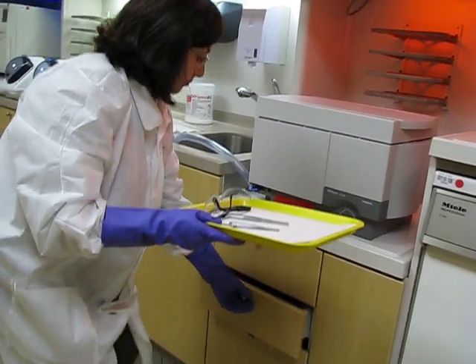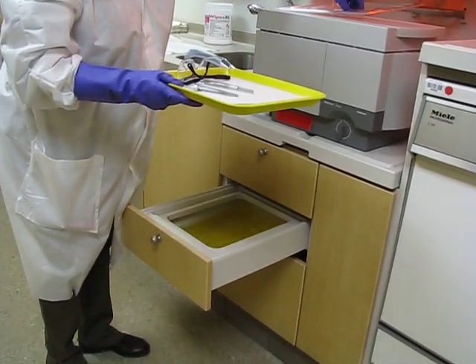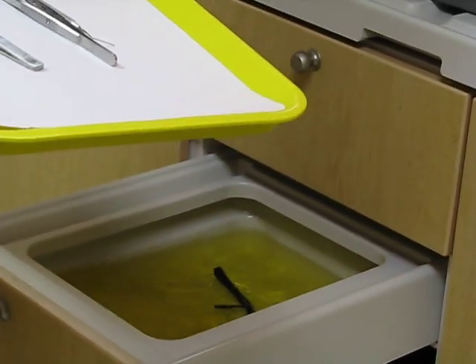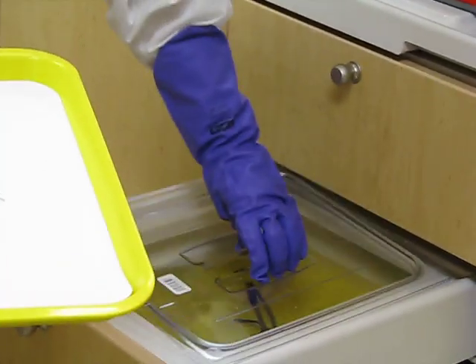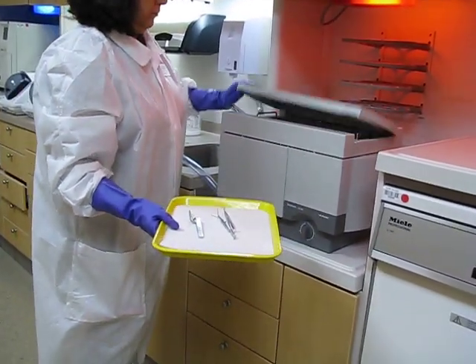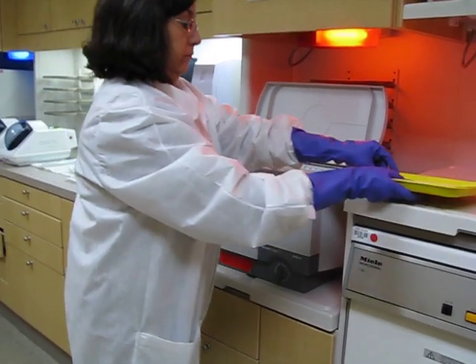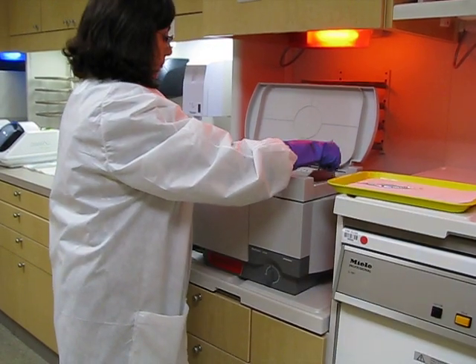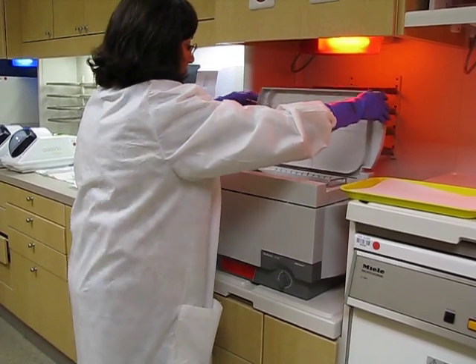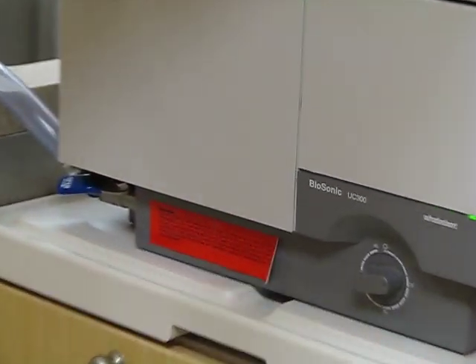Ms. Gonzalez will take the safety glasses and put them in the cold, then cover and close it so it's out of the way. Then our dirty instruments — she's going to place them in the ultrasonic for 15 minutes. She lifts up the basket, places them in, closes it, and puts it on for 15. That's the noise it'll be making.